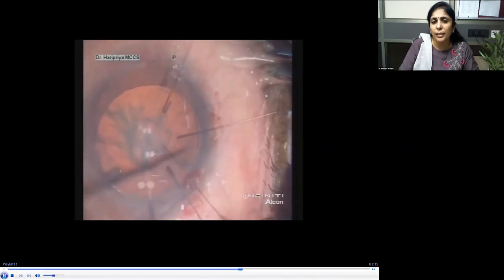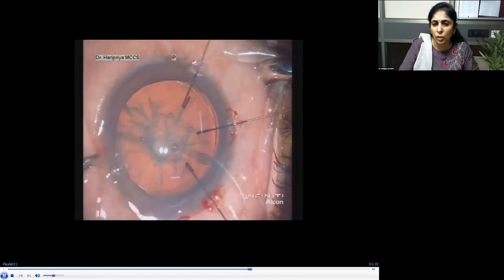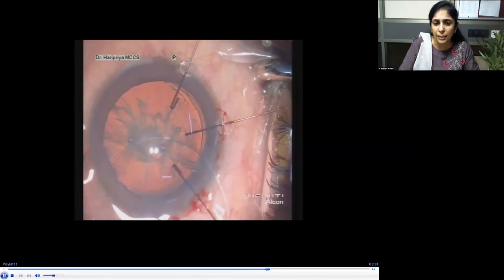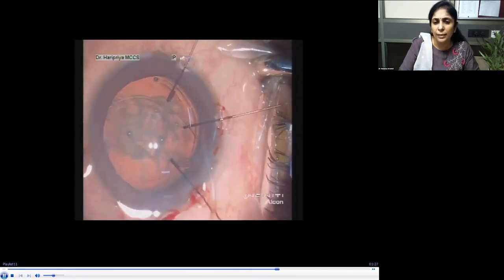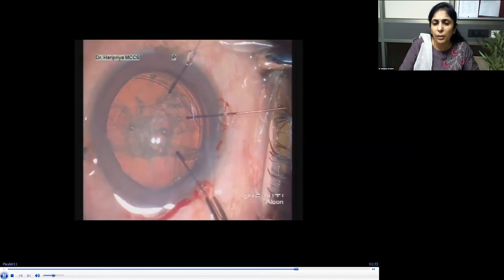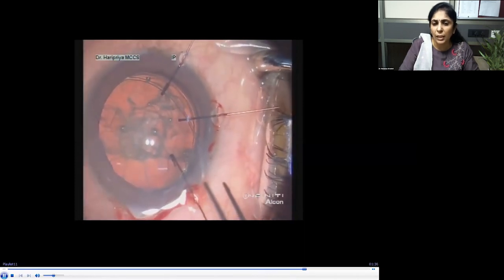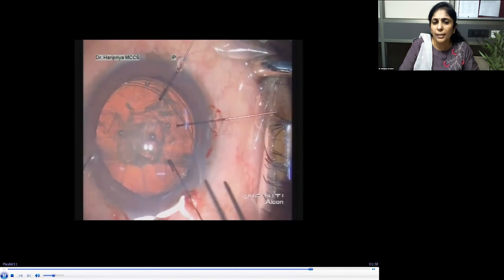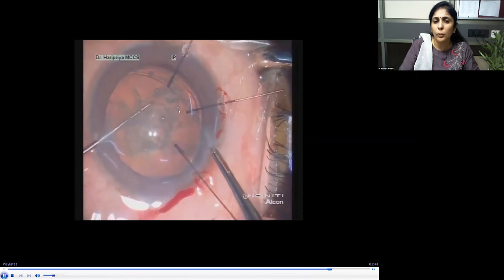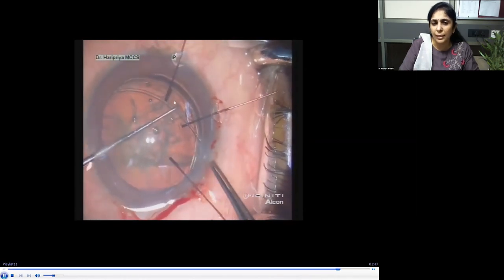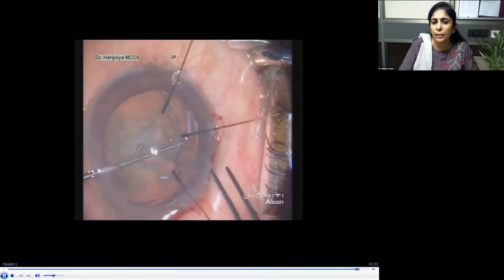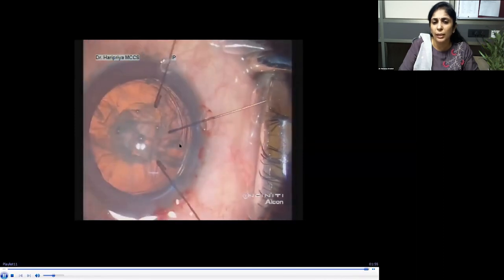After the hooks are in place, I prefer to do hydrodissection before inserting the CTR, because cortex removal becomes difficult once the CTR is in place. After hydrodissection, I insert the CTR manually through the side port rather than the main tunnel so the chamber stays well-formed. The leading eyelet goes into the bag, and the trailing eyelet is dialed using the Sinskey hook to ensure it doesn't slip into the sulcus or angle.